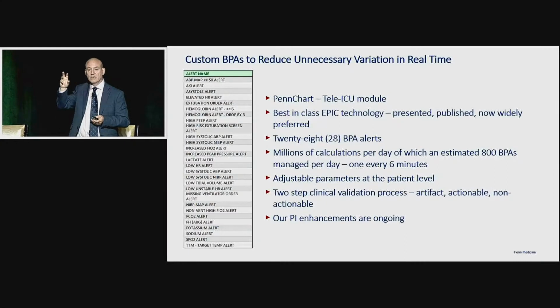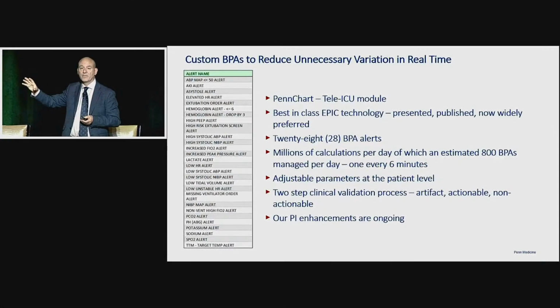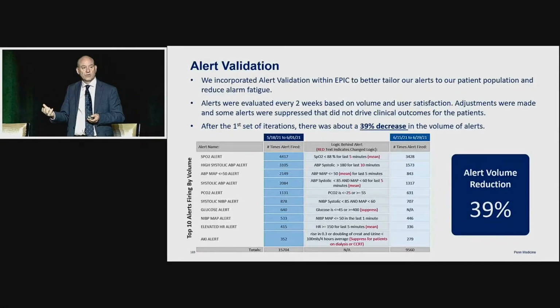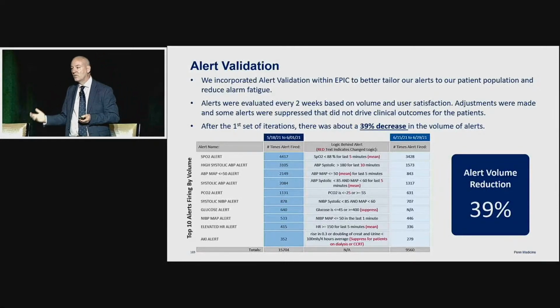So if we've got a cardiac patient, we can just click, all right, cardiac data set for that patient. Well, we might tolerate a different MAP, for instance. And there's a validation process associated with every BPA, which is basically, is it an artifact? Is it actionable? And if it is actionable, follow the action, and how do you do it? But the first thing we did was we used third-party software, and we actually got rid of 40% of the noise, which has been incredible. And then also we don't fire the alarms audibly. Nothing is audible. If you walk into our unit with 450 ICU beds, there isn't a single sound. There's no alarm beeps, because it's just distracting, it's overwhelming.